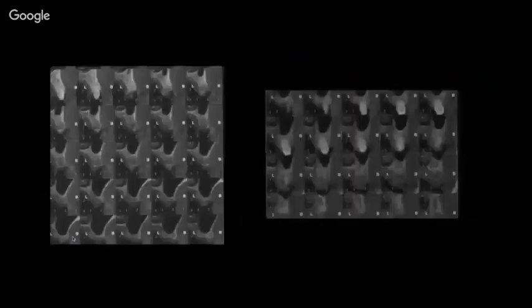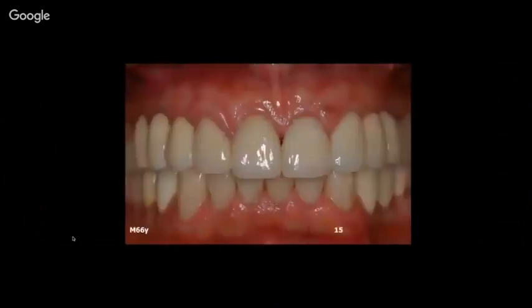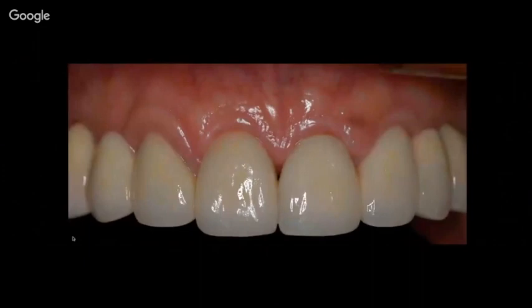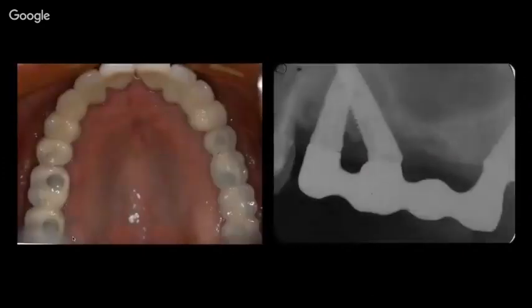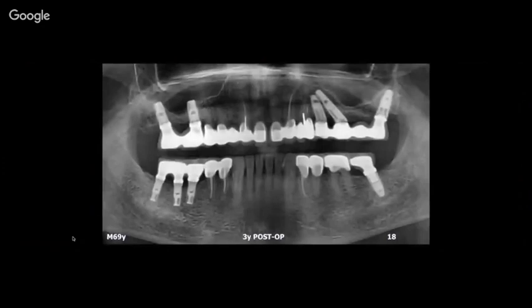After studying the CBCT, nice tuberosity. This is the reconstruction made by Dr. Abu Jawde. And then what to do in the back, you can see it now. We had to put 1 implant in the tuberosity and 2 implants in different axes along the sinuses. And you can see it here 3 years after.